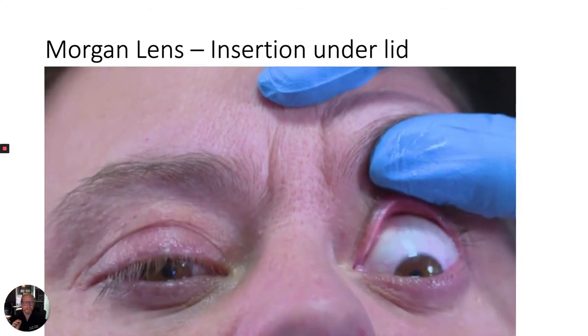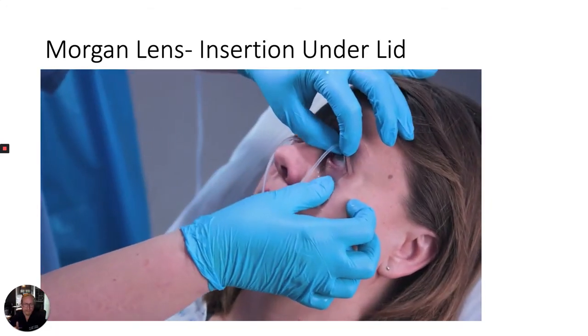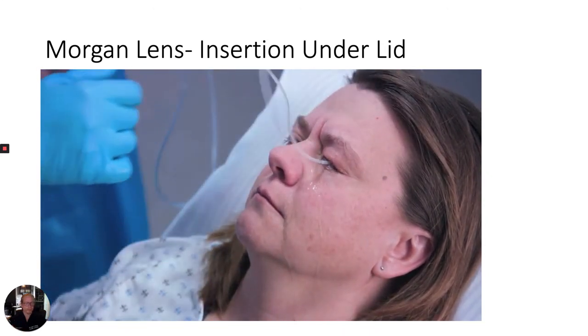To place the Morgan lens, first retract the patient's upper eyelid and instruct them to look downwards. Then gently insert the Morgan lens under the upper eyelid. Next, have the patient look up. Retract the lower eyelid and drop the lens into place. Tell the patient that they can let their eyes close, and please tell them to keep it closed.